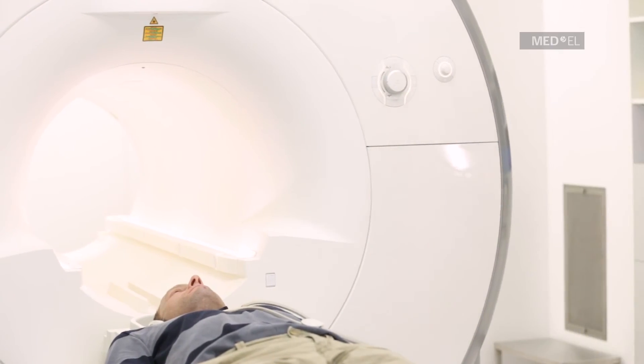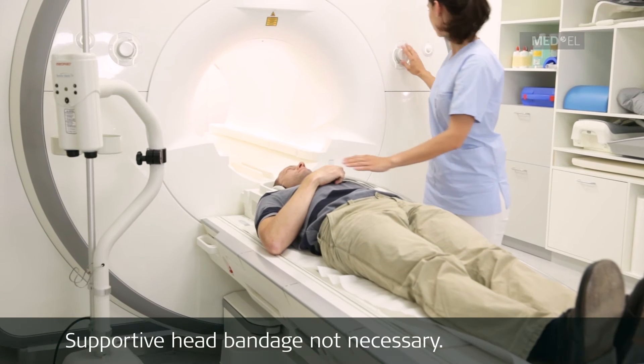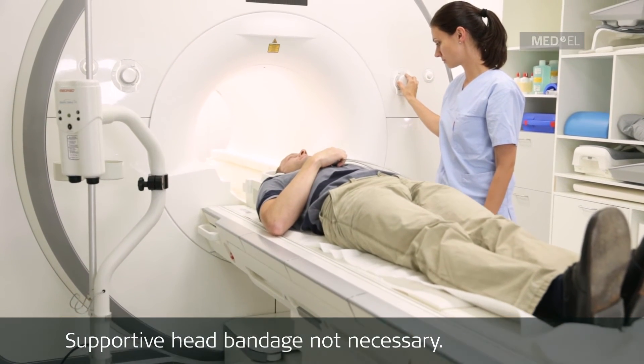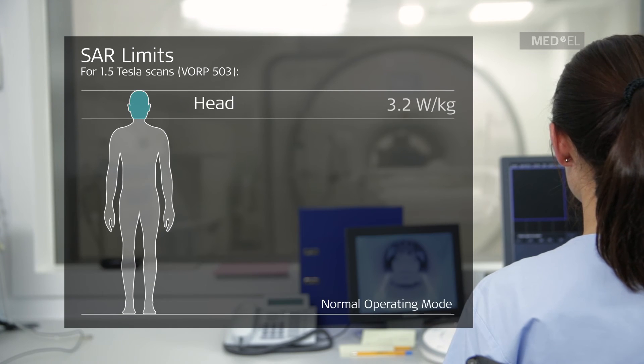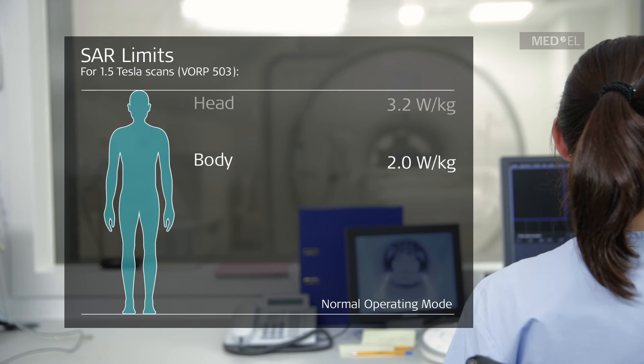Patients with the SoundBridge VORP 503 middle ear implant can be safely scanned at 1.5 Tesla. A supportive head bandage is not necessary. Run sequences in normal operating mode only — that is, a head SAR limit of 3.2 Watt per kilogram and a whole body average SAR limit of 2 Watt per kilogram.